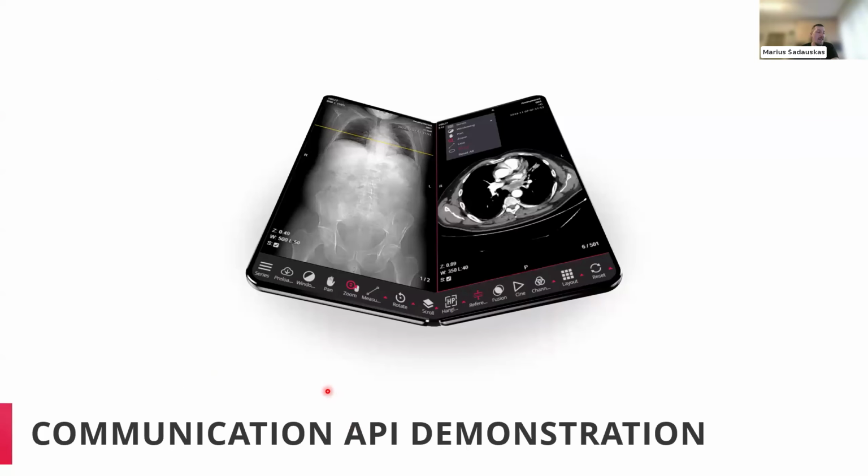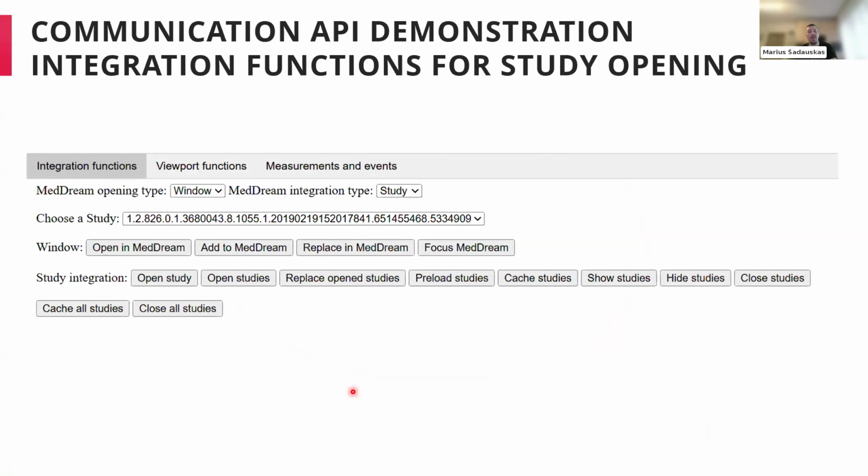Okay, let's go to this API demonstration. I'm talking too much.